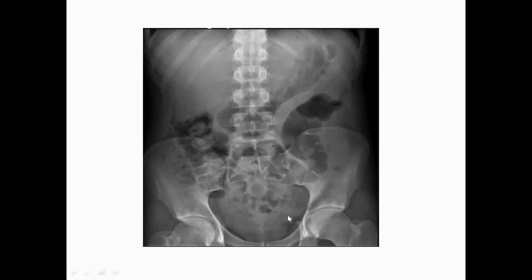What is the indication for the abdominal X-ray? If the patient comes with acute abdominal pain, when you suspect abdominal obstruction or perforation. Although the most sensitive image for perforation is the erect chest X-ray, to see the free air, for patients who are critically ill and cannot stand erect, the abdominal AP view can still be helpful, as it shows a couple of signs we're going to discuss later on.